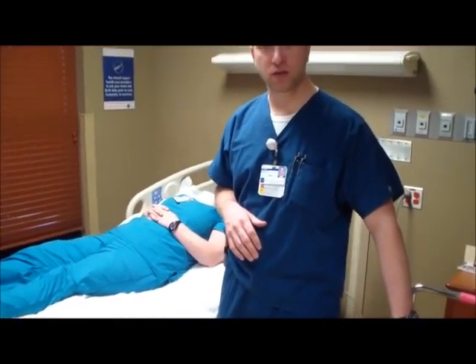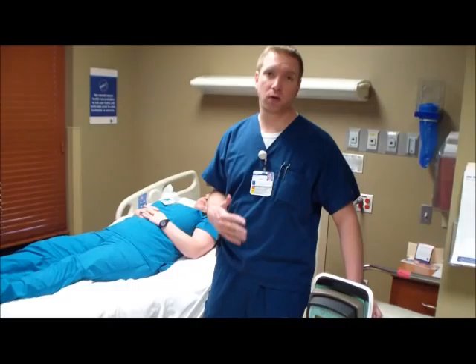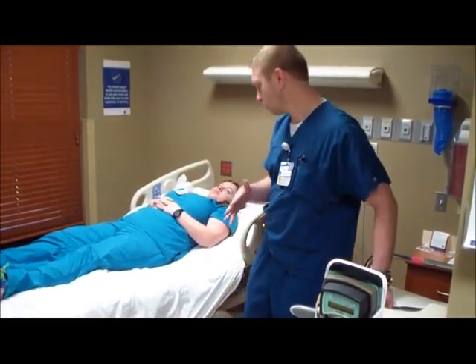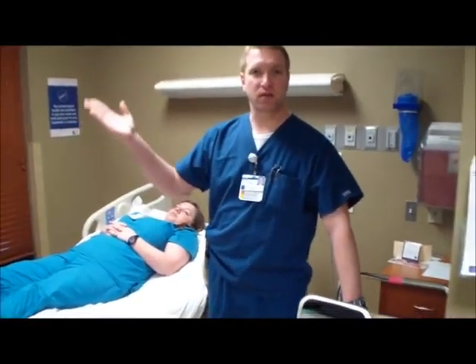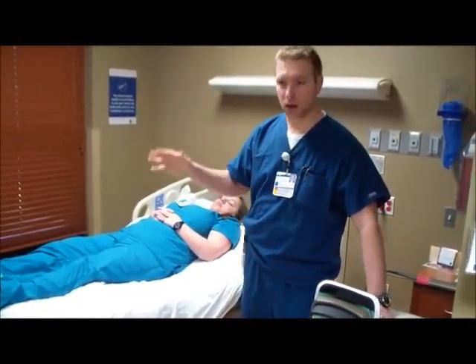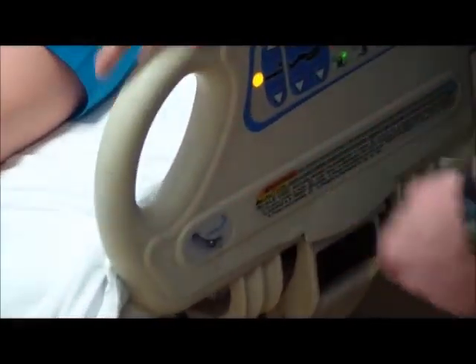And patients may ask you if they can sit up a little bit higher. Unfortunately, once the CPM is applied, we can no longer adjust the height of the bed. I would say roughly you want to be at about 10 to 15 degrees of the bed being up, and you can actually see that by a little measuring tool right down here.